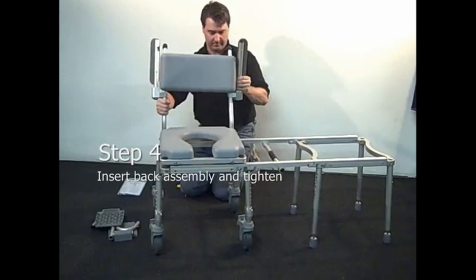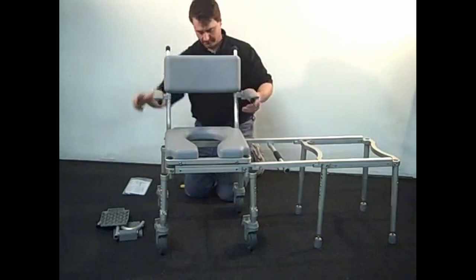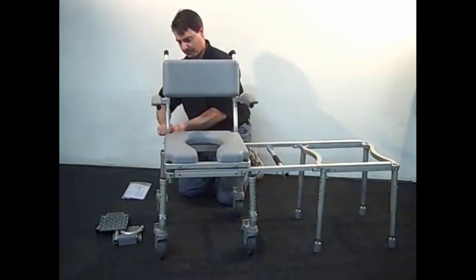Next, install the backrest assembly. The backrest posts fit into the rear holes on the slider seat frame. Tighten the internal back post clamps using the T-handled Allen wrench.